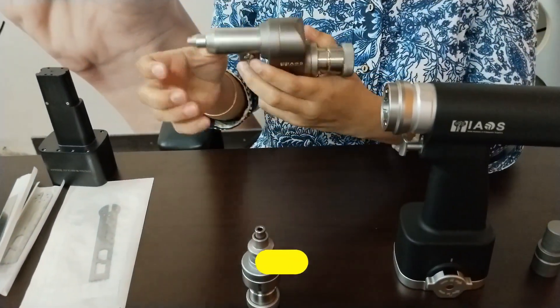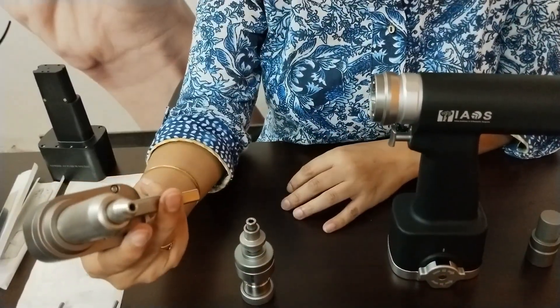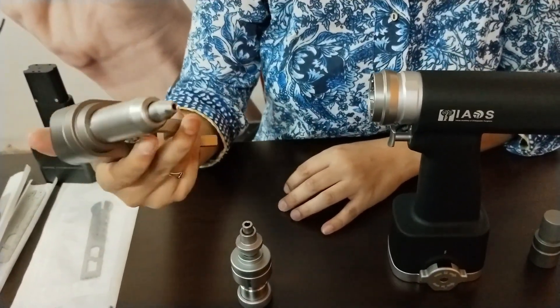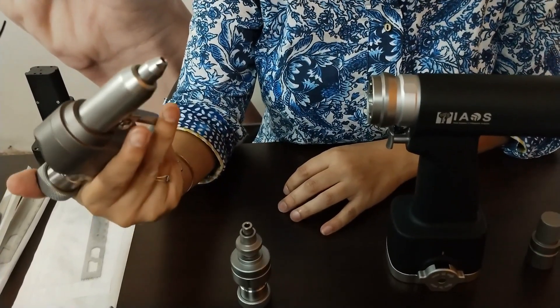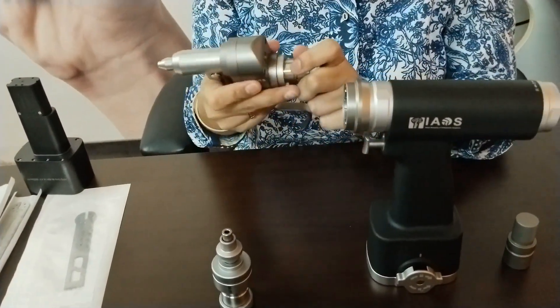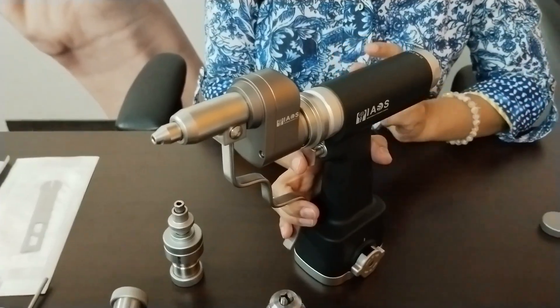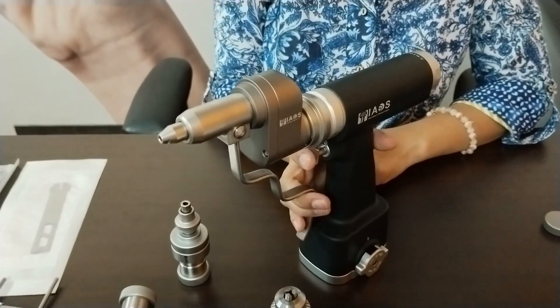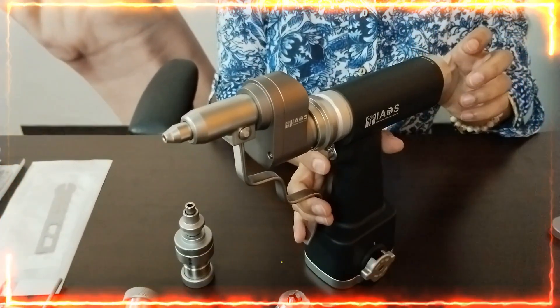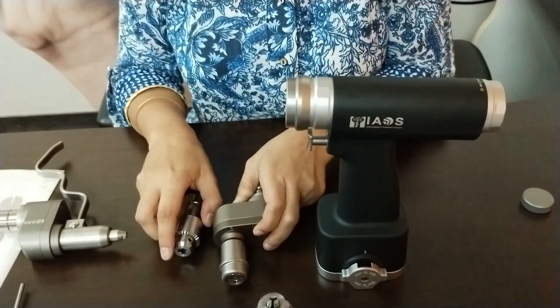This is the K-wire attachment. It allows the insertion and removal of K-wires and guide pins of about 1.5 to 3.2 mm in diameter. You just push back the chuck lock and it has a snap fit. It works in two modes — forward and reverse.